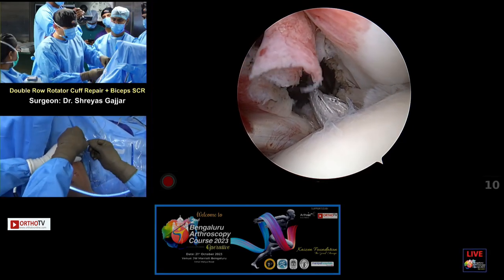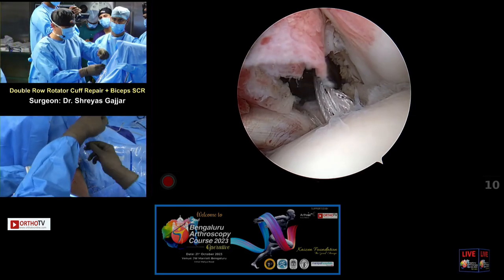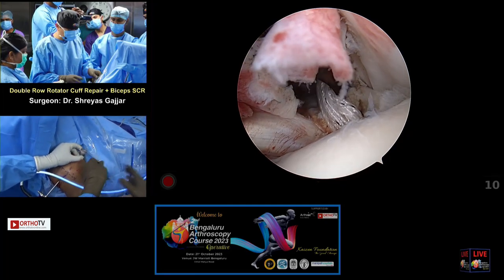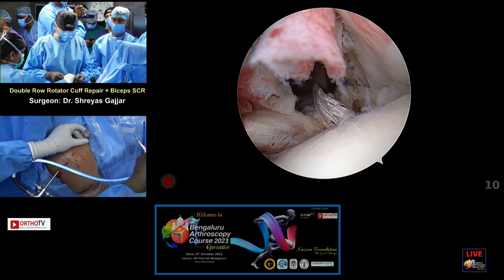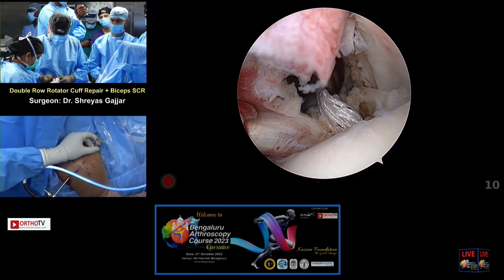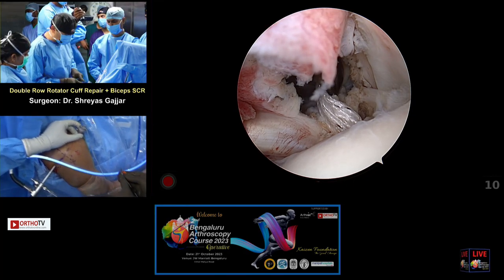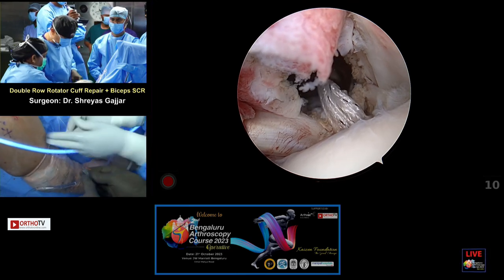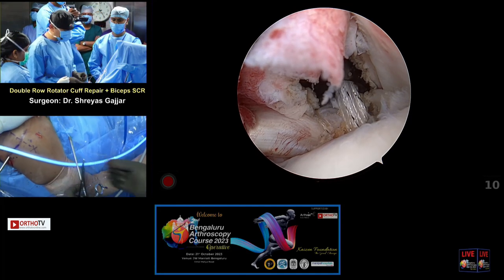So your anchor is coming through which portal? The anterior inferior portal. So we've removed the eyelet suture. Can I have the tape cutter, please? On a tape cutter. Thank you. If you put the pad, please, from below up, yeah, thank you. Fantastic. So now we're just going to cut the excess part of the tapes. If you have the outside image.